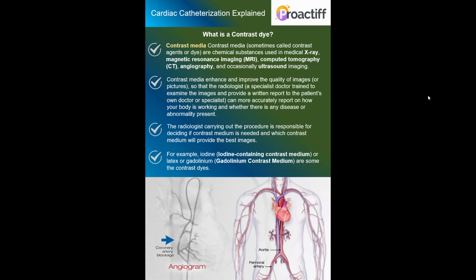The radiologist carrying out the procedure is responsible for deciding if the contrast medium is needed and which contrast medium will be used for the best imaging. For example, iodine, or latex, or gadolinium in the case of some of the contrast dyes.